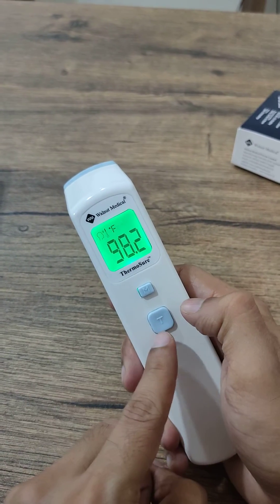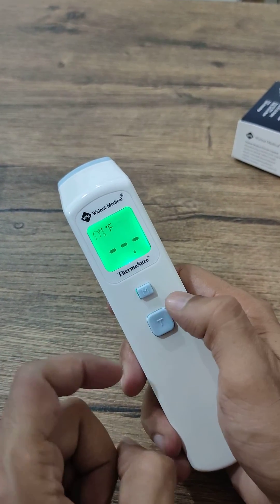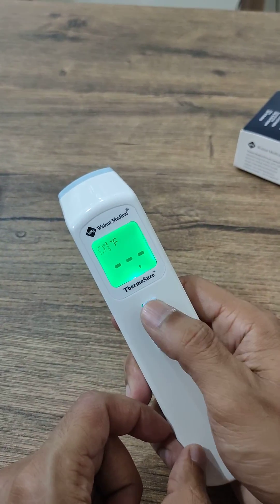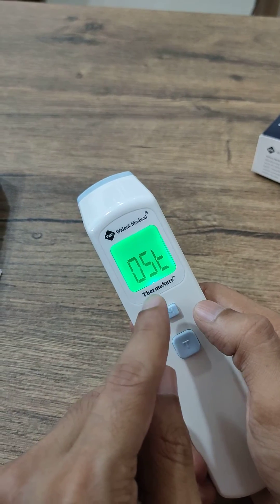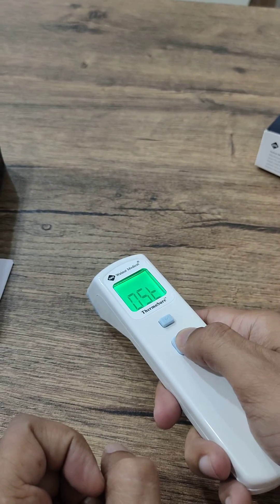If you press mode again, it goes into storage mode, which shows temperatures taken in the past. I've only taken one reading, so it's showing just one. The next mode is OST — object surface temperature.